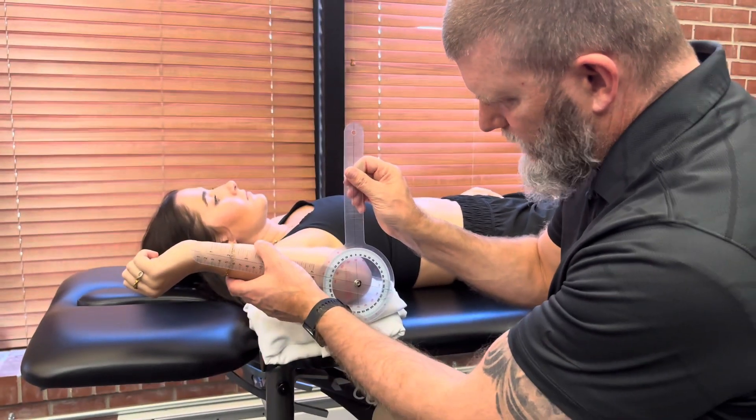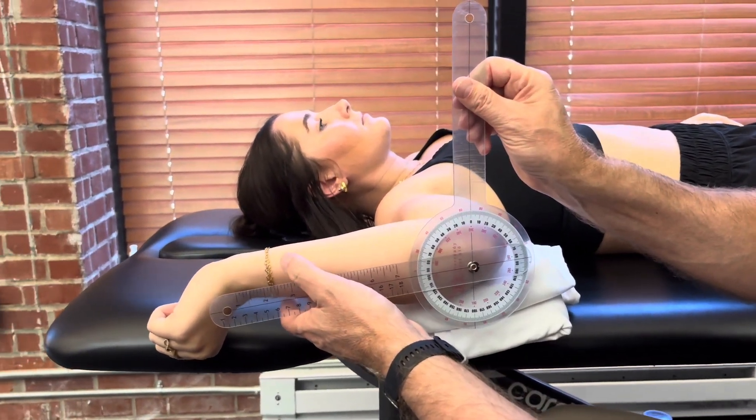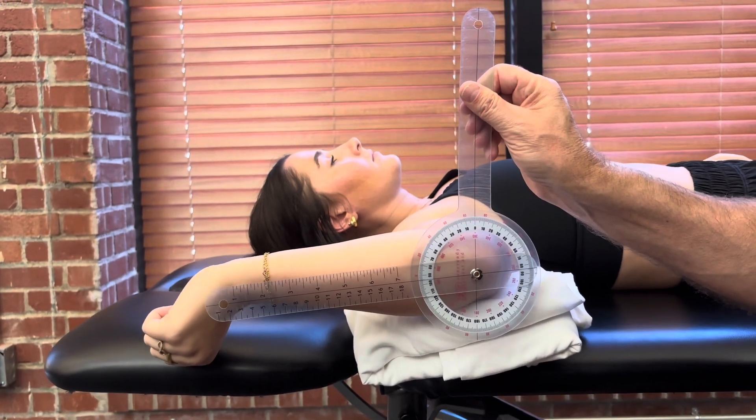Now go ahead and go back as far as you can take it. I follow her there, and for total composite shoulder motion she has 95 degrees.